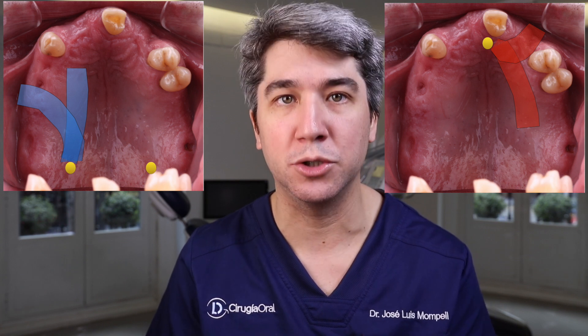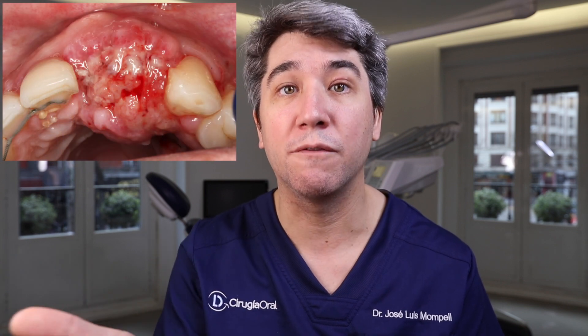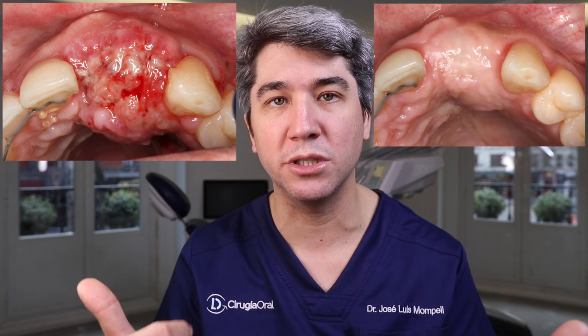Just in case we have a wound dehiscence of the mucosa, we will find a second layer of connective tissue that will prevent the bone from exposing to the oral cavity, contaminating and leading to a total or at least partial loss of the graft.